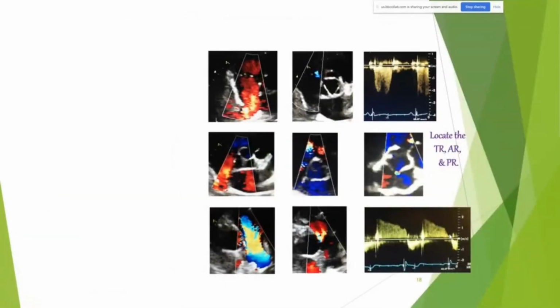So you guys are going to help me out here. Janae? Yes. I need your help real quick. Okay. Is this tricuspid regurgitation? Yes. What about this one?